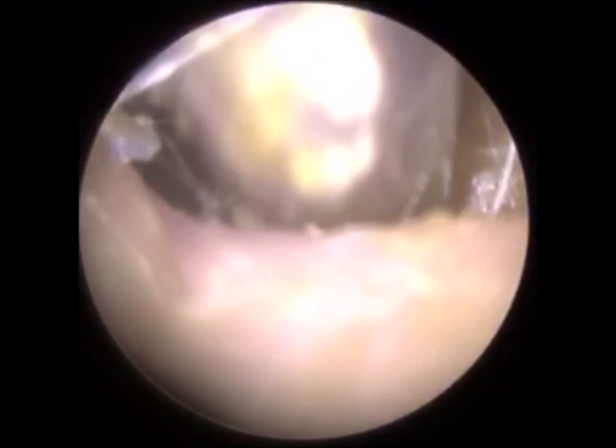Or with this piece of keratin, I may have managed just to vacuum it out because it's a bit softer and it's a bit more pliable. Now, using the forceps again just to pull that through, but again, it just sliced it into a smaller piece. So gone with the Jobson horn, just trying to get in behind that plug, and here we have managed to get some of it through the ear canal. It's quite damp, quite moist.